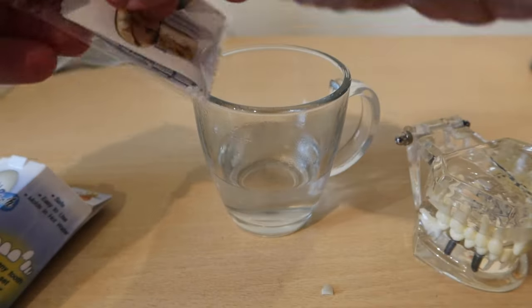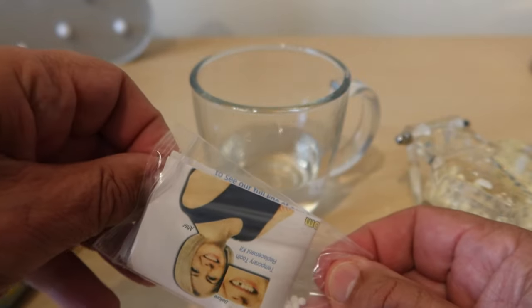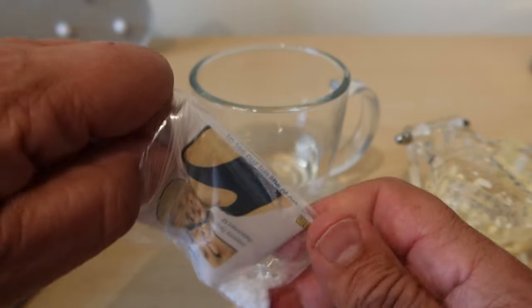So you need a cup of hot water — not too hot, obviously you don't want to burn yourself. We're going to put about half of these beads into the cup.